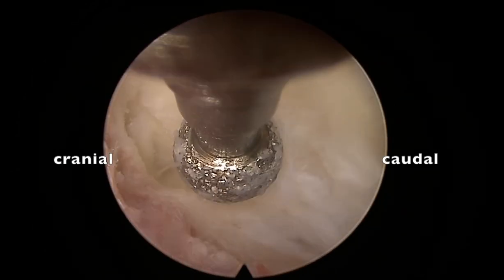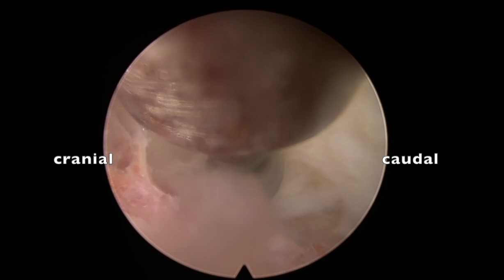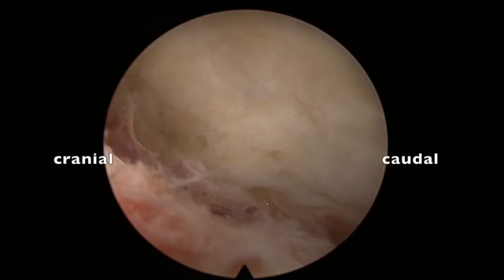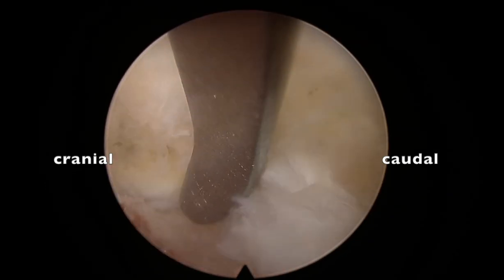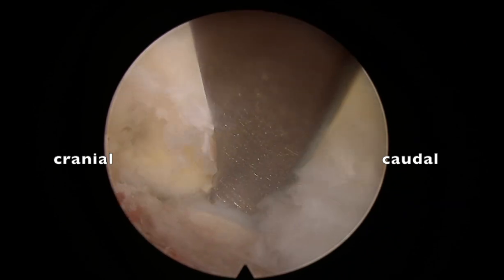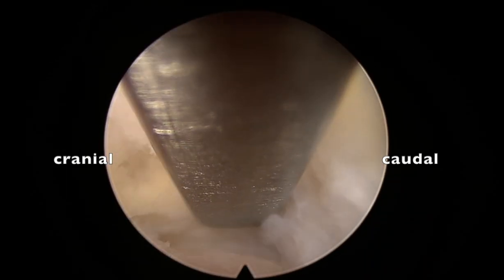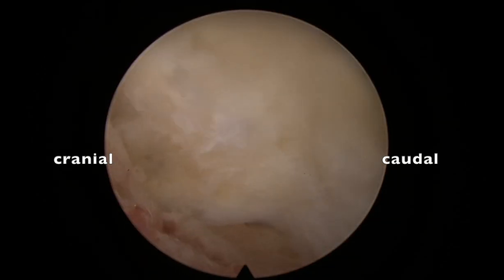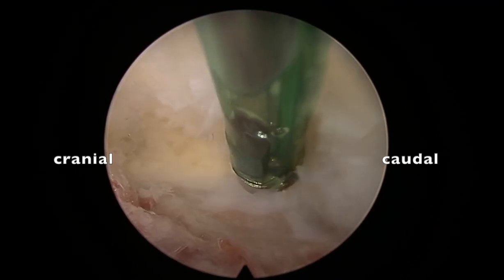Now I am drilling the inferior facet towards the lamina. You can see the superior facet is getting exposed. I'm using a diamond burr so that bleeding from the facet will be stopped. That's the superior facet, which I have delineated. That is the area we need to drill so that the recess opens up completely.